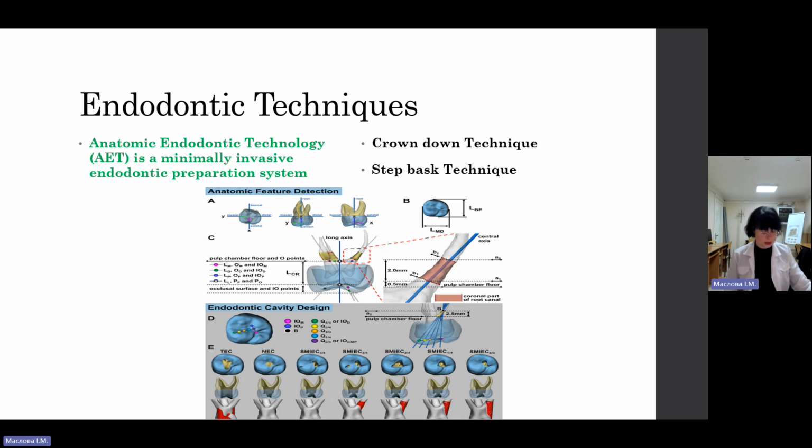interference, simplifies instrument penetration, increases apical tactile sensitivity, reduces canal curvature, minimizes working length changes during preparation, and allows penetration of irrigating solution down to the full depth of the preparation, which reduces bacterial accumulation before apical instrumentation. Thus, the crown-down technique minimizes potential iatrogenic apical contamination, reduces the area of contact between the instrument and the canal wall, so reducing torque, increases cutting efficiency and safety, and reduces the frequency of procedural error.